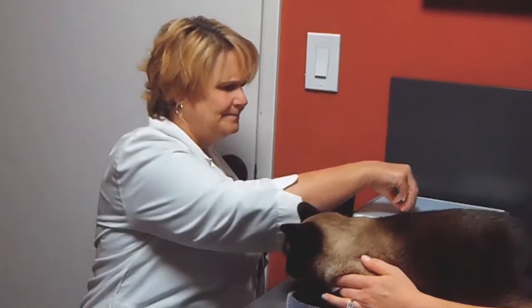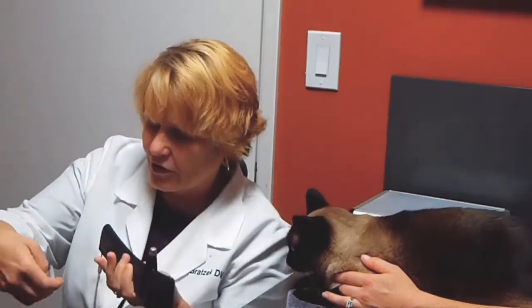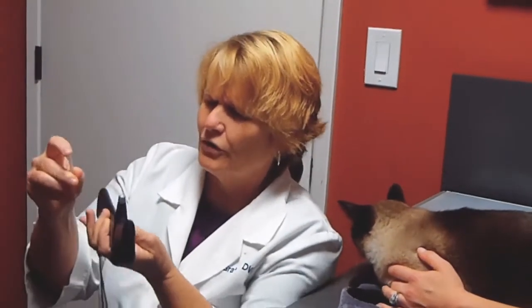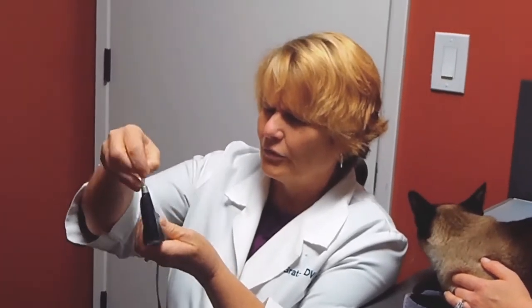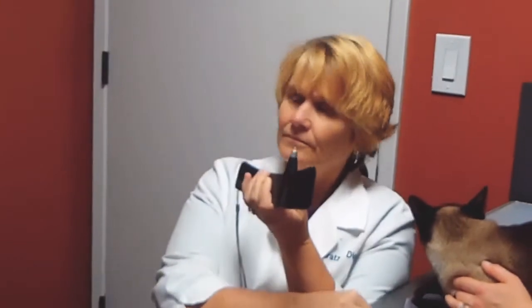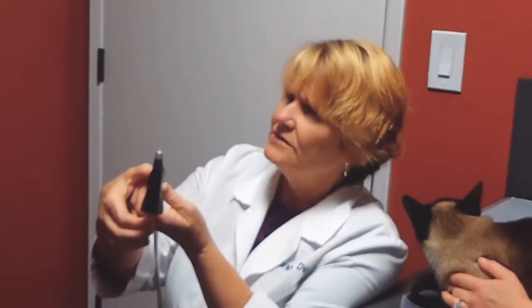We've got our Tonavette, we have our sterile probe. We're going to load our probe into the barrel, press the button once to calibrate, and we're ready to go.